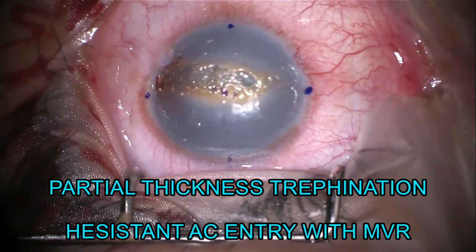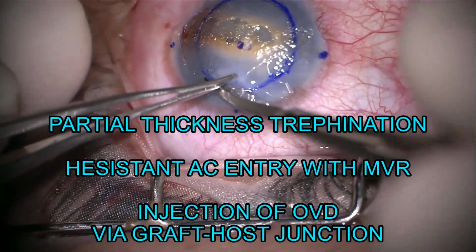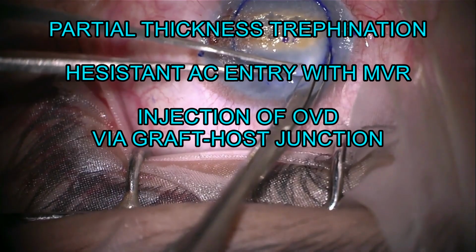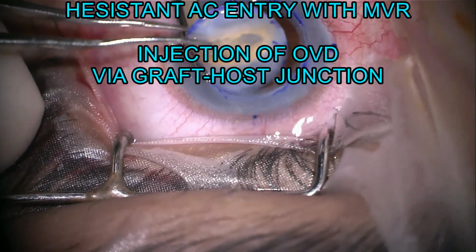So where did we go wrong? A partial thickness trephination at the beginning with hesitant AC entry and injection of OVD via the graft-host junction could have led to host Descemet membrane detachment. The retained Descemet membrane was not detected intraoperatively.